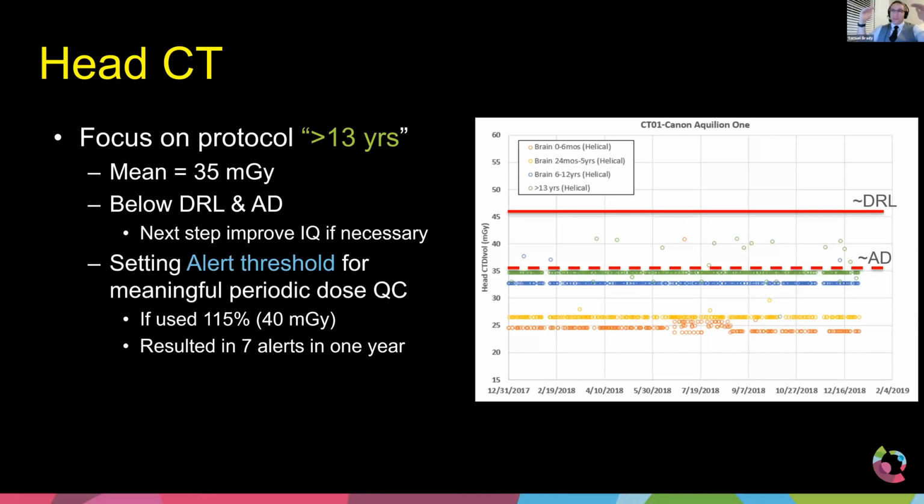And for a very busy hospital, or a hospital like yours where maybe you share a radiologist and share a physicist, then maybe it is good to have that really upper level, because then they will get email notifications immediately. Even a key radiologist like a chief or an optimization radiologist will get that email, and they might not even be on service that day, but they'll go, "Oh, something happened," and so they can jump in. So you can do it, but let's be honest, a lot of the time the CT scanner itself will catch a lot of those mistakes. Well, not mistakes, but issues, and it'll let you know about it.